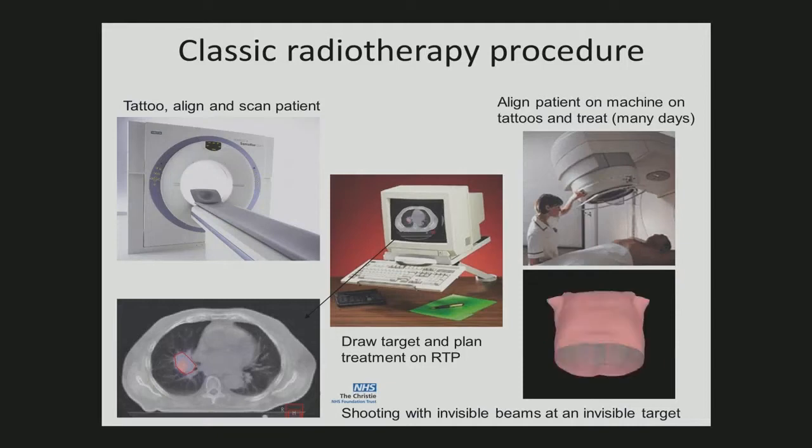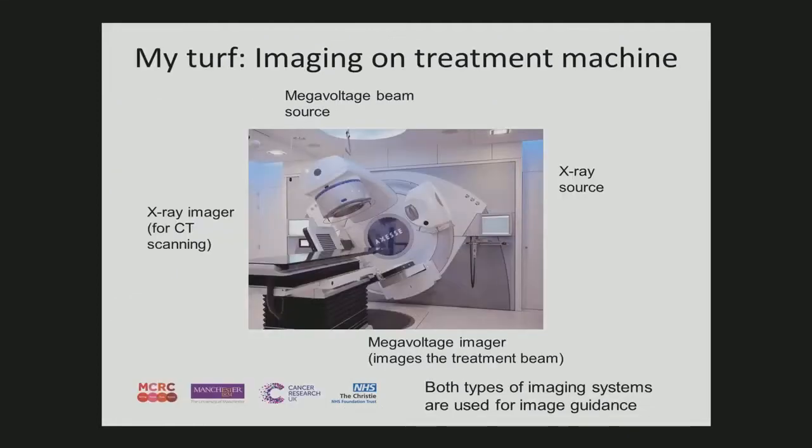And then eventually the patient is moved to a big treatment machine where those beams are actually shot at the patient. And well, at first you can see that there is a little bit of a problem, because you're shooting with invisible beams at something that you can't see, because you can't see inside the patient unless you have a scanner. By the way, it's fine to ask questions at any point in time or interrupt at any point in time.